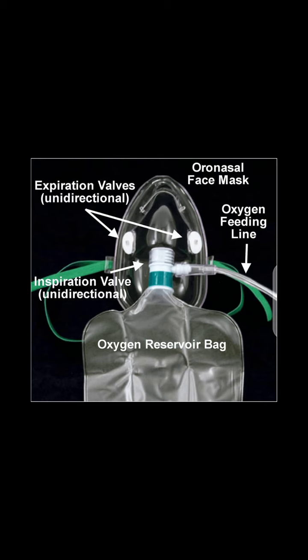And the reverse is also the case. When the patient exhales, the expiratory valves will open to allow CO2 to escape. At the same time, the inspiratory valves will close up when the patient expires, and this is to prevent the entrance of carbon dioxide into this reservoir bag.